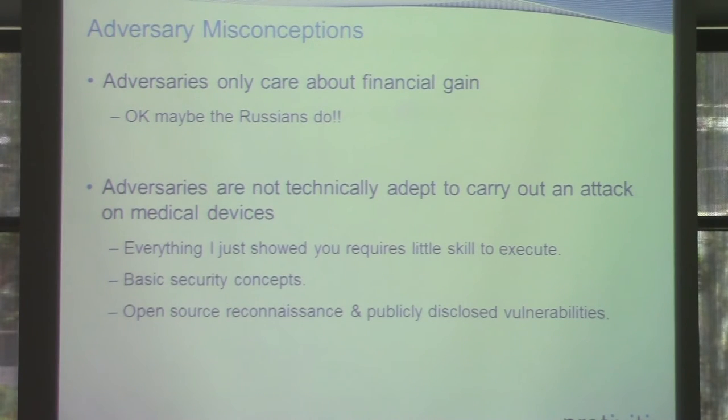But when I got the FBI PIN, the Private Industry Notice, what stood out to me was that this is the first time the federal agency has actually put it in writing. And inside of there, outside of the headliner, 4.5 million patient records, it also said the attackers specifically target medical devices. So what are they doing? Because a lot of the other stuff they're doing is for financial gain, it probably was for IP rights, trying to figure out how to knock off their competitors. There's a big push, if you understand, medtech in China.